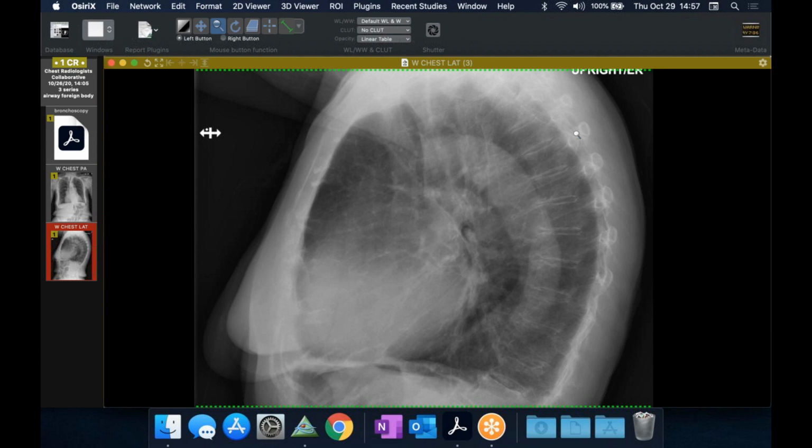Yeah, I thank you for that explanation, because I've seen that. We actually have 2 COVID patients on ECMO right now, and one of them has some pretty white-looking lungs. David, if you have patients and we think that's going on, I'm interested in lung edema from the point of view of, can you distinguish hydrostatic lung edema from acute lung injury edema? With the ECMO-related left ventricular problem, that ought to be hydrostatic lung edema. So I'm really interested if you have cases that really seem to be that entity. I'd like to look at the radiographs and, if you have a CT, analyze the pattern of the lung edema. That could be potentially interesting.